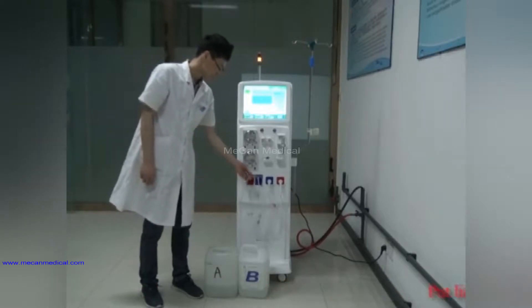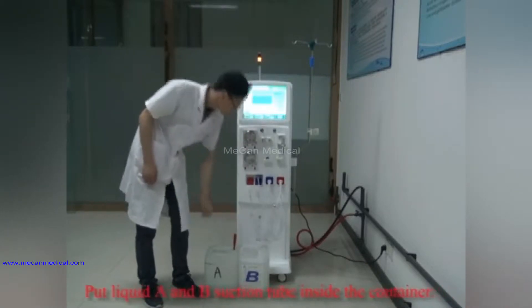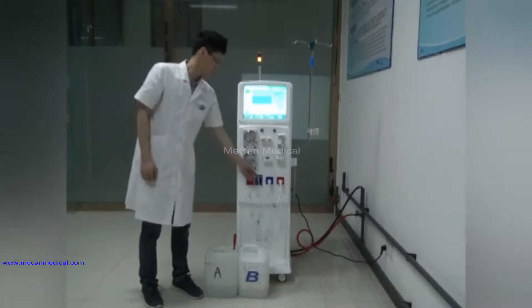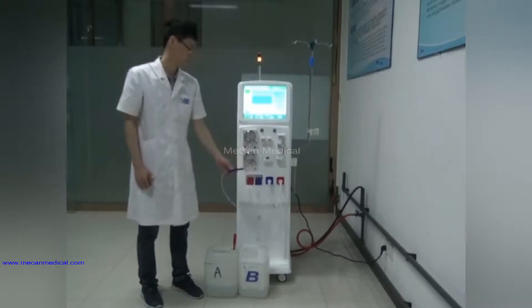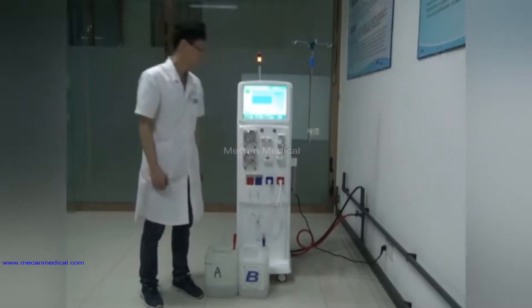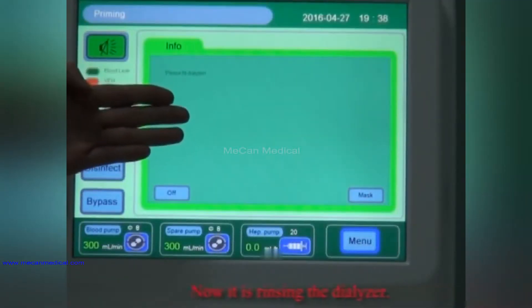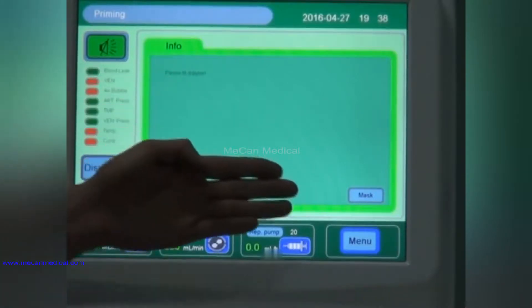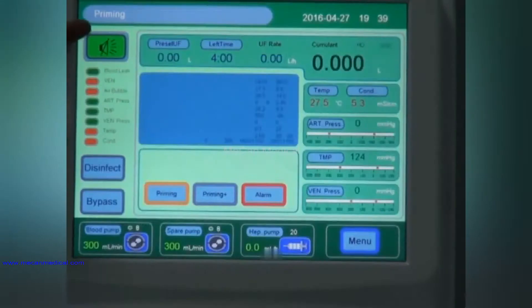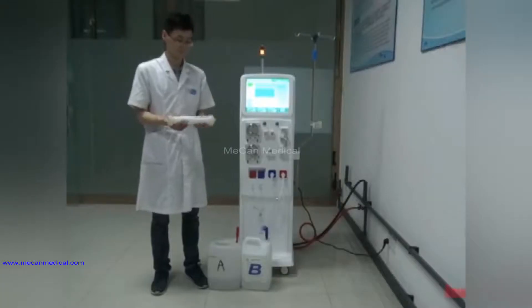Put the liquid A and B suction tubes inside the container. Now the machine is rinsing the dialyzer. Now it is in priming status. Install the dialyzer.